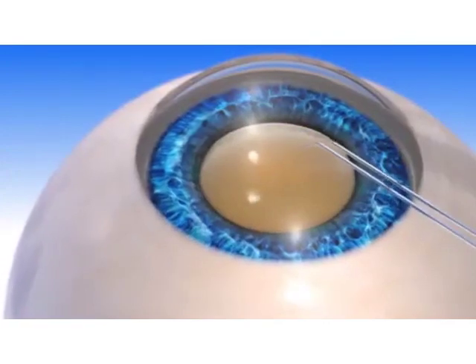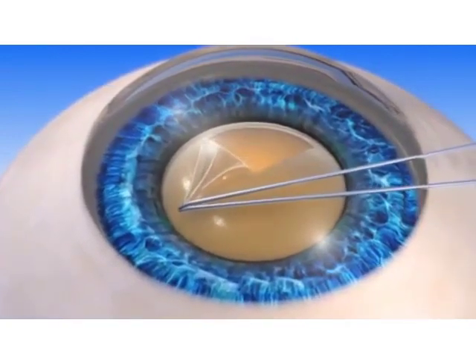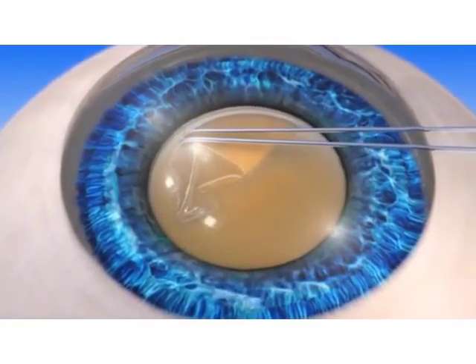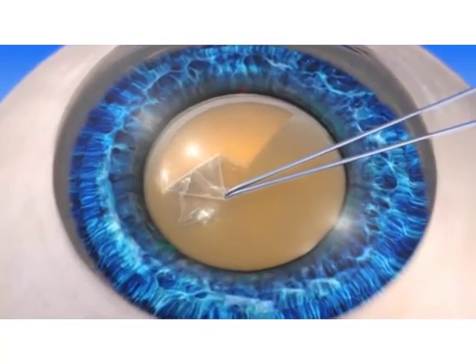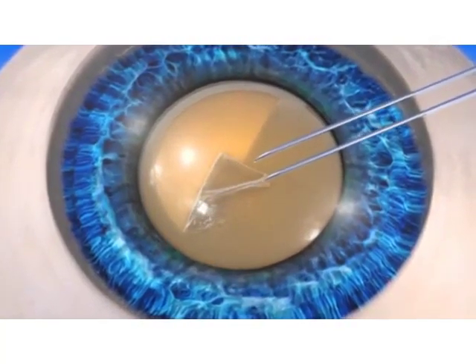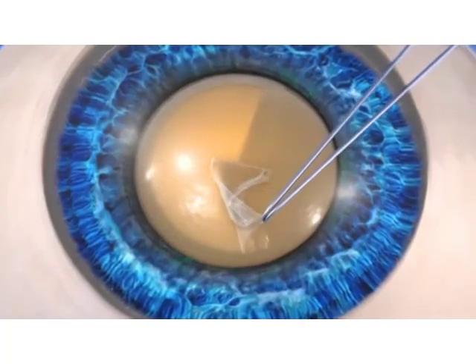The next step in cataract surgery is called capsularexis. During manual cataract surgery, the surgeon uses a hand-held instrument to cut and gently create a circular opening in the sac that holds the lens, called the capsular bag or lens capsule. This provides the surgeon with access to the cataract. Capsularexis is a critical step in cataract surgery because it can affect how an implanted IOL will be positioned in the capsule.